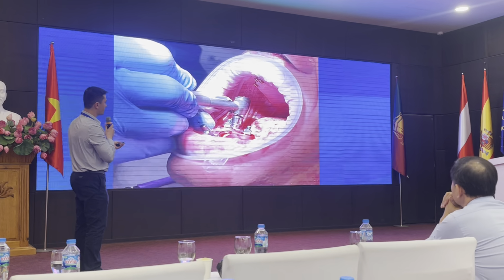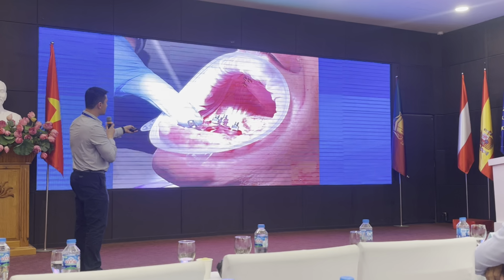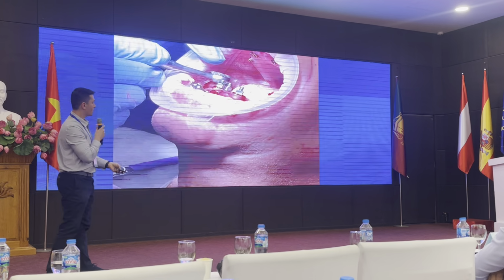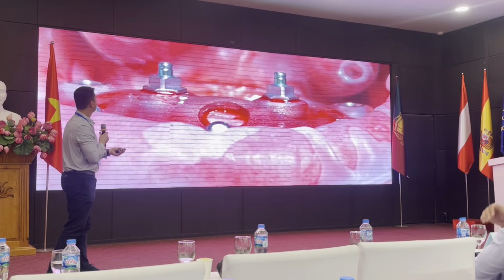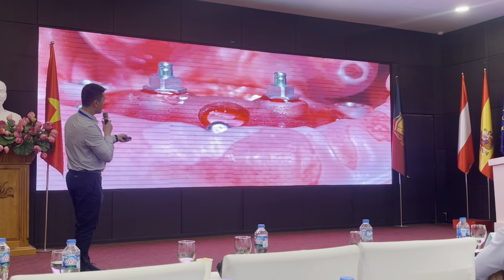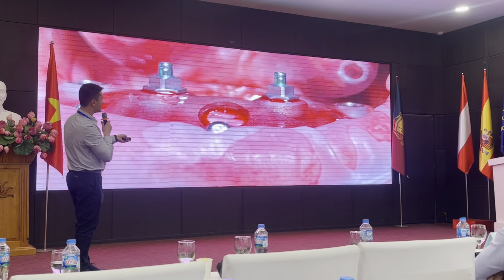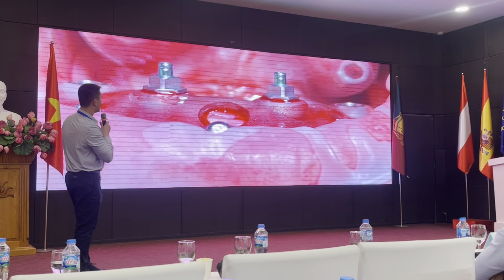So I start in the front, work my way toward the back, and each time these implants go in and seat all the way down on the surgical guide, they act like an anchor pin. They hold the surgical guide in. We also make sure that the hexagon shape of this fixture mount is matching the metal sleeves of the surgical guide.